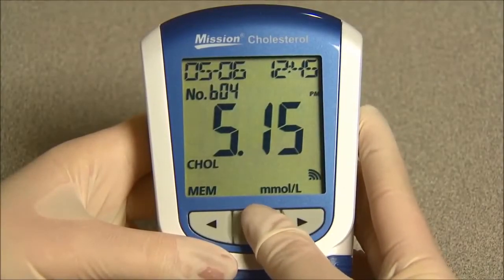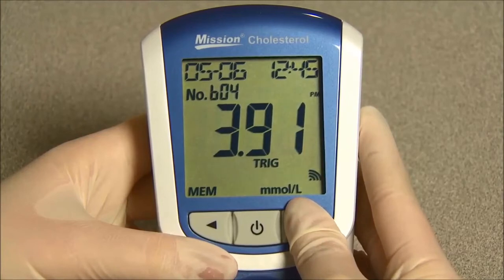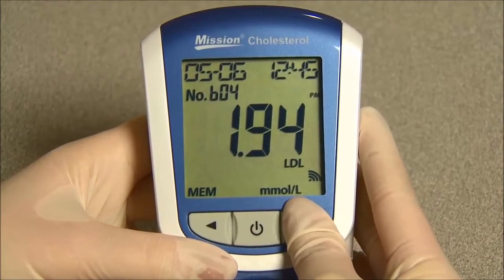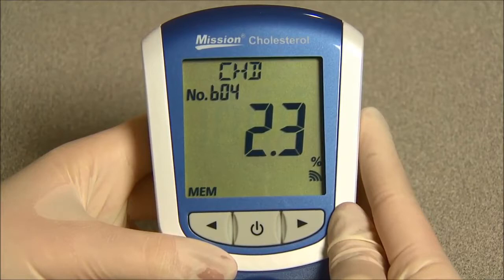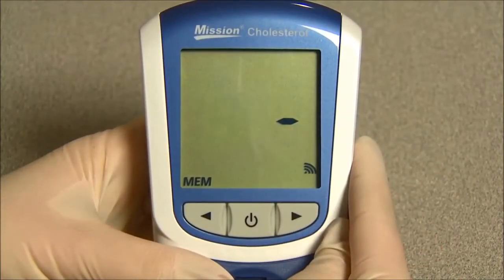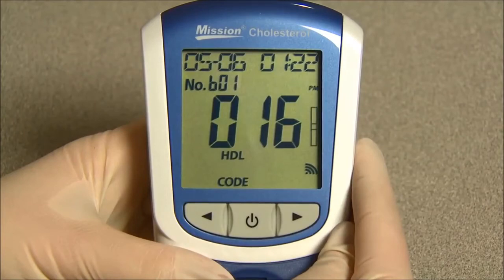To view the three-in-one test results, press the power button to enter the record. Then press right to view each result parameter of the three-in-one test, such as total cholesterol, HDL, triglycerides, total cholesterol HDL ratio, LDL, and CHD, if the coronary heart disease evaluation has been enabled. If no data is stored, the meter will display one dash and MEM. Press and hold the power button to return to the initial screen.